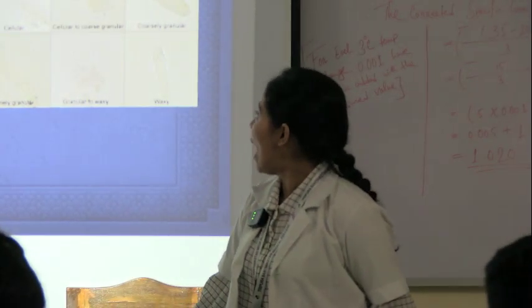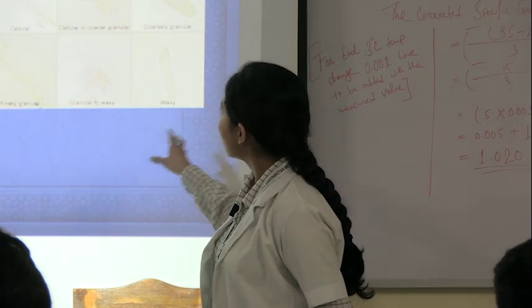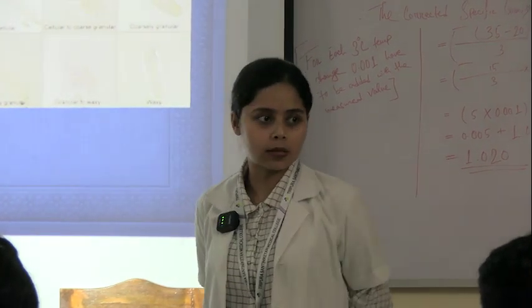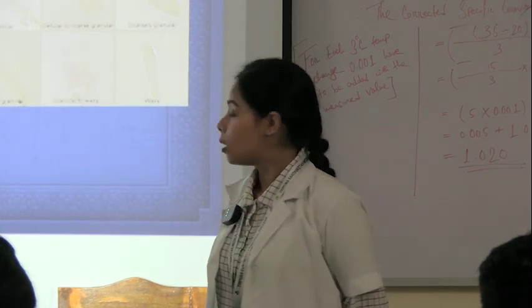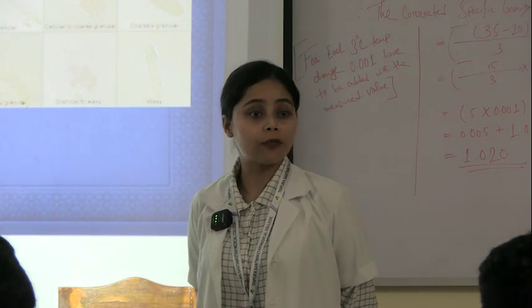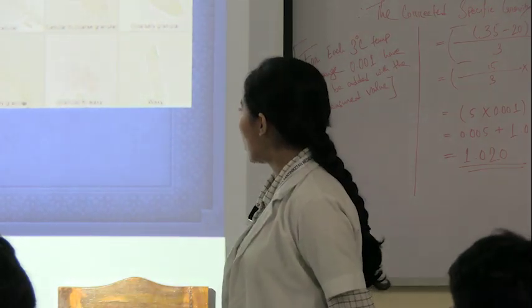So yeah, so the hyaline and this waxy, this cast, you can see the hyaline is one of the most common casts. So casts are basically the clumped up cells. So the hyaline are one of the most common casts that you can see, and this waxy cast will be seen in chronic kidney patients. This waxy cast, these are very common in chronic kidney patients. Then the granular cast, okay.